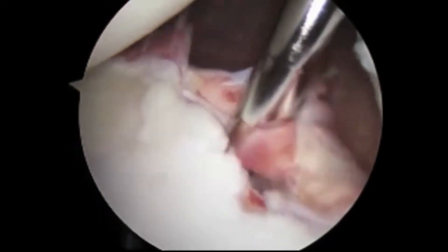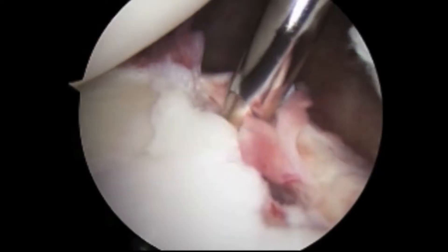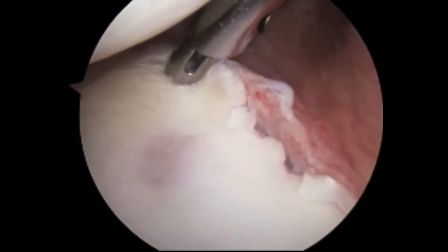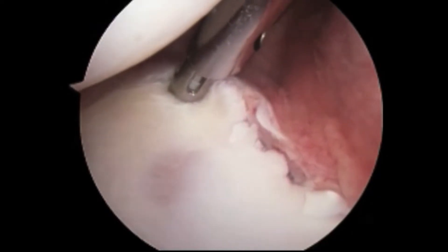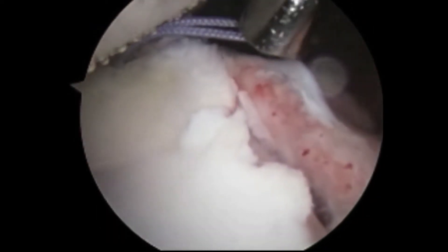A motorized shaver is used to remove the soft tissue and provide a bleeding response. Here we are placing an anchor that will allow us to repair the labrum back to the bone. The suture here is colored purple.